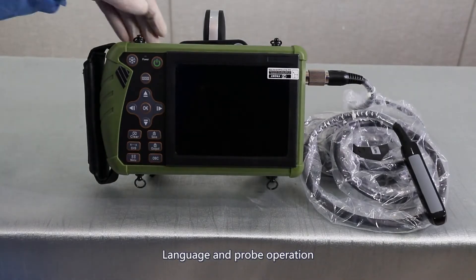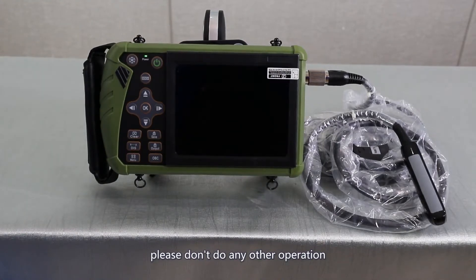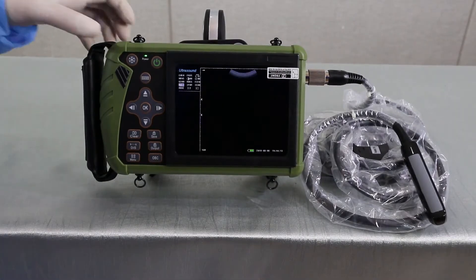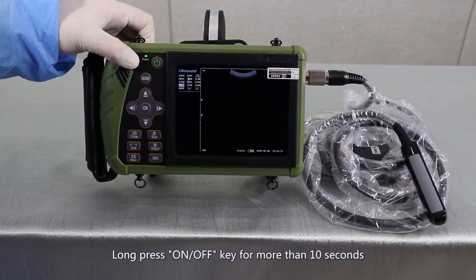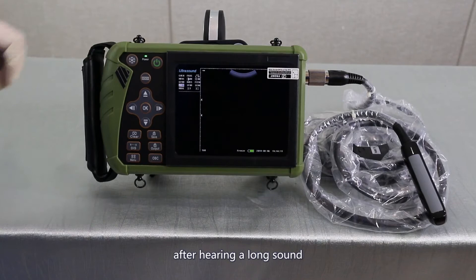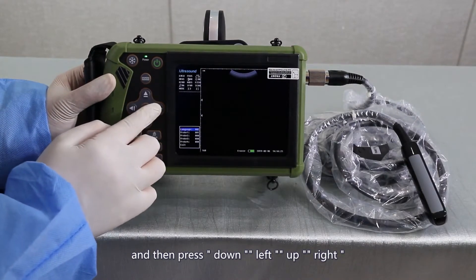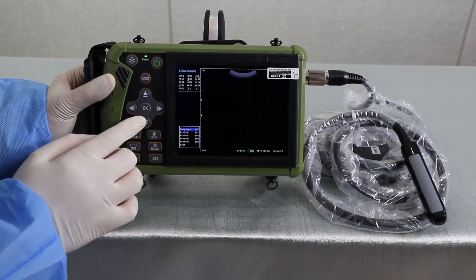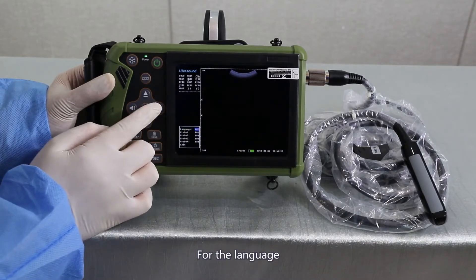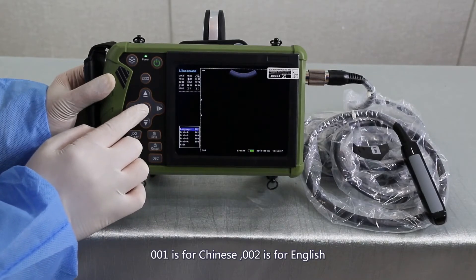Language and probe operation. Turn on the machine and do not perform any other operation. Enter into the system. Long press the freezing key for more than 10 seconds. After hearing a long sound, press down, left, up, right to enter into the parameter set bar. Use the direction keys to set the language and probe. For the language, 001 is for Chinese and 002 is for English.